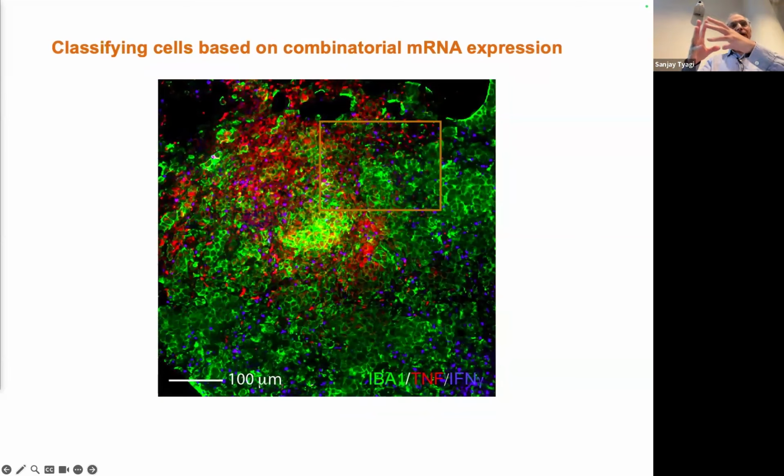I'm going to transition to this slightly more complex experiment where we did multiplex labeling in a solid granuloma. It's an early granuloma, about 4 weeks. And here the blue is interferon gamma. The colors have been changed. The green is the macrophage marker IBA1, and the red is TNF. TNF is sort of central to macrophage activity.